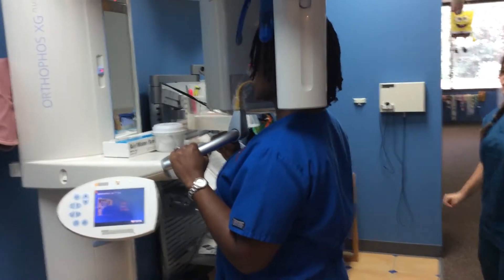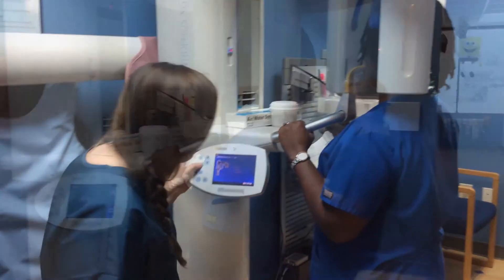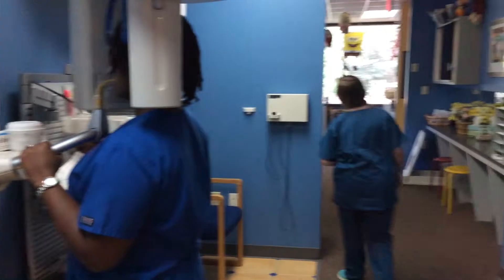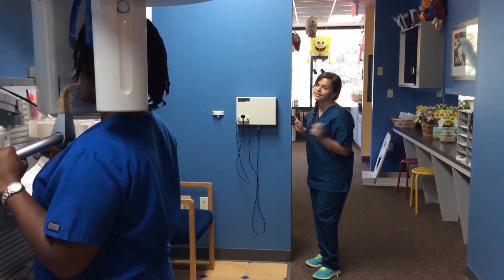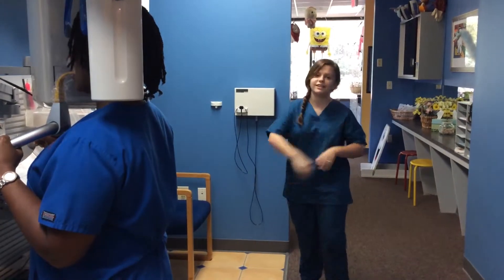Are you forgetting something? What am I forgetting? Oh, your head — we got her brain suckers. She can't move anywhere. And then I would come over here, mash the button until it stops, and then she would have her picture. And we're done.